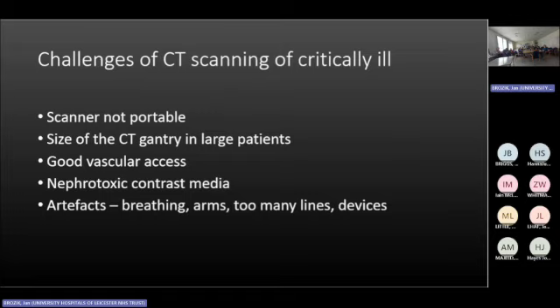If you worked in the United States, you could have seen it. It's the same thing as an X-ray machine. It's just bigger, heavier. There's a lot of radiation, and it's a small scanner. It's just for the head. You can't do the whole body. But I understand that argument.